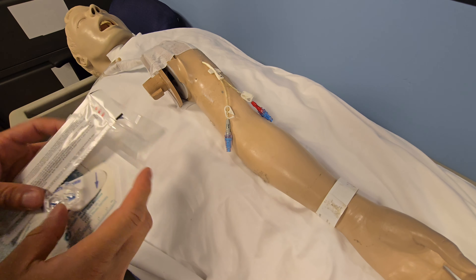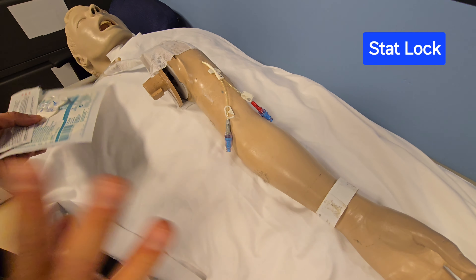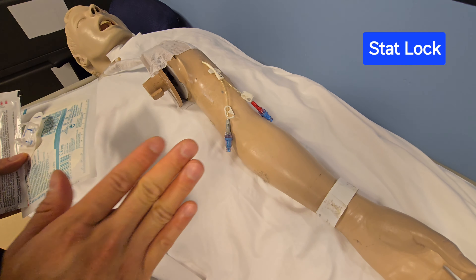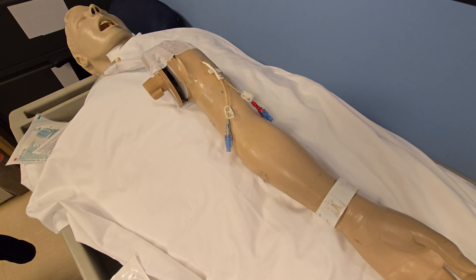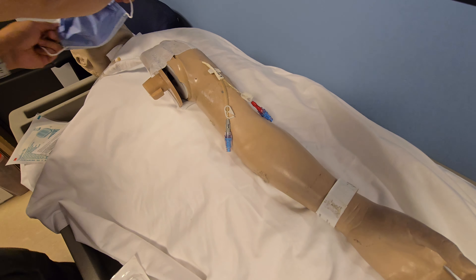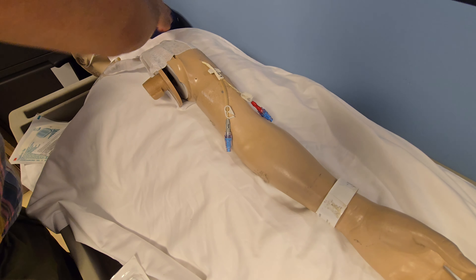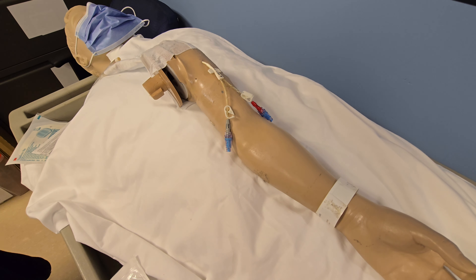We're going to start with our stat lock, and this is the package it comes in. Now for all three, we're going to have universal precautions. When we change any central line dressings, the patient must wear a mask. The reason why is because we don't want the patient to accidentally cough and sneeze onto the site, because that can be one of the sources of infection.